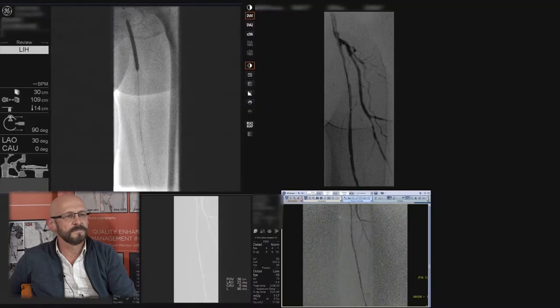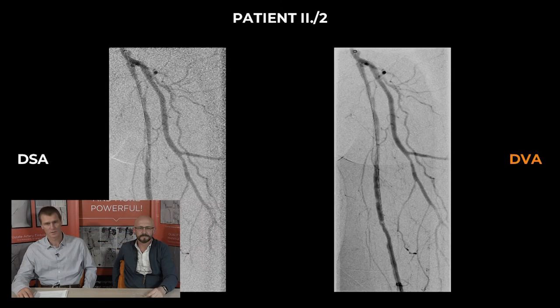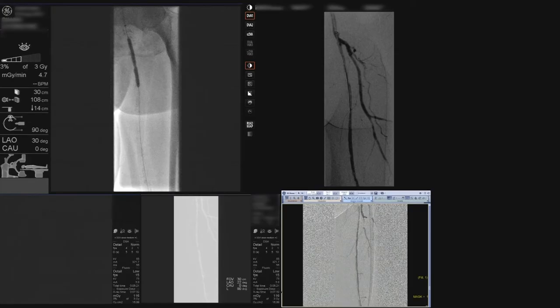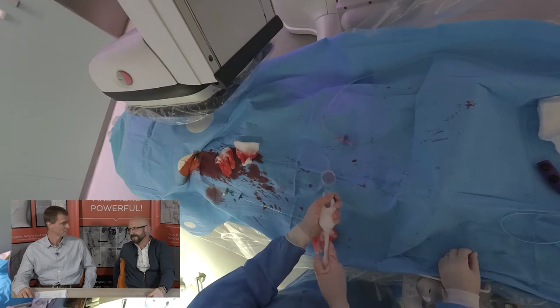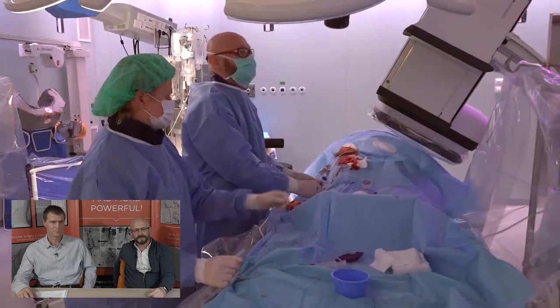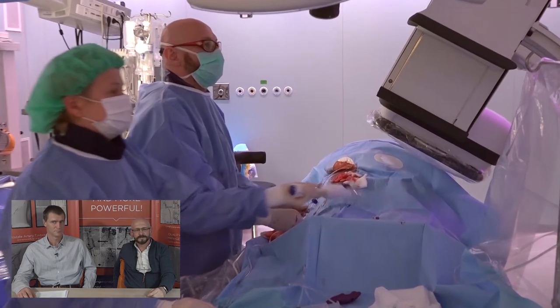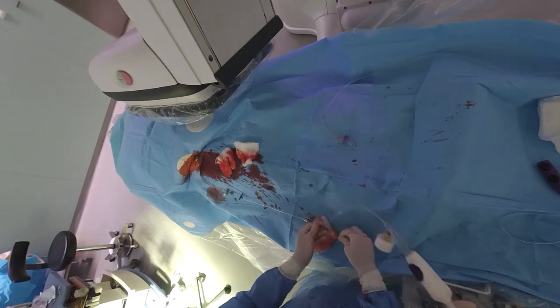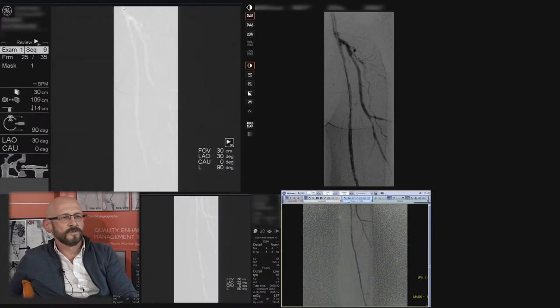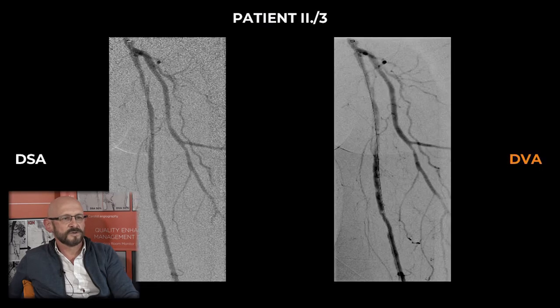This is the proximal part of the superficial femoral artery. When you see these side-by-side comparisons, the DSA is the result of heavy post-processing while the DVA is just as it counts — less noisy. The problem with these patients is usually a very noisy image when there is a big patient on the table. After removal of the balloon catheter, another control image was taken, which looks pretty good. I can see some dissection proximally.